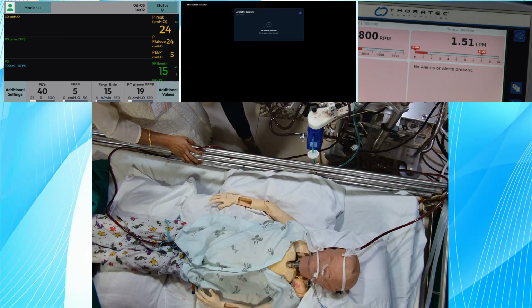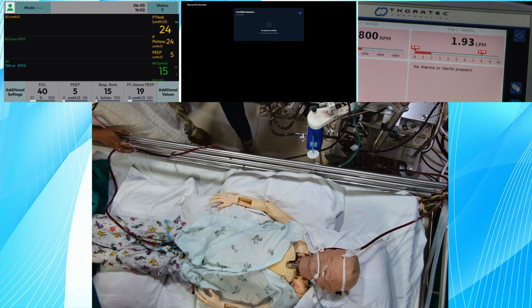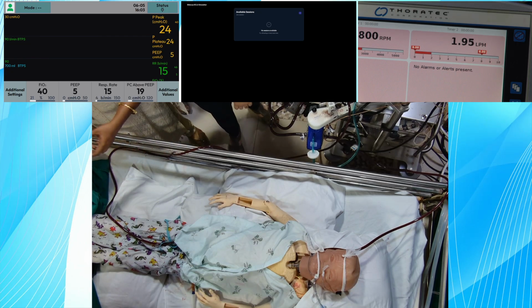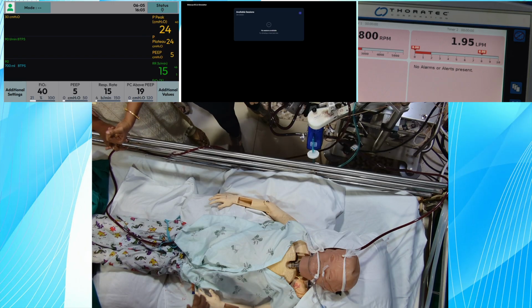Wait, don't switch it on yet. Let me make the changes in it. So what else can be the cause? I want to check and look at the ultrasound, and then I'll make the change. Pneumonia. But meantime, the focus is the oxygenator change. Are we going to rule out the machine causes?